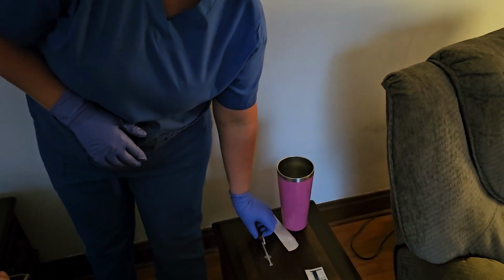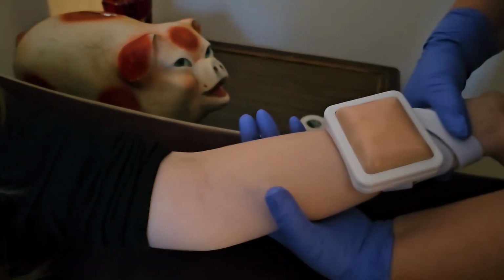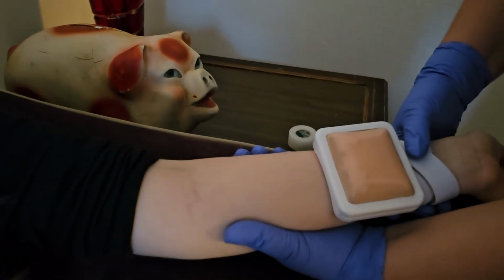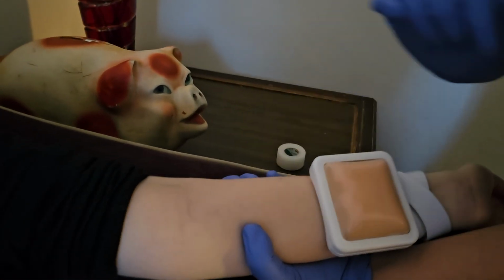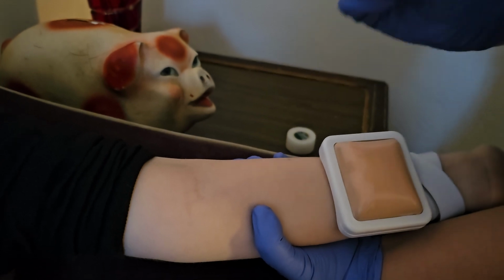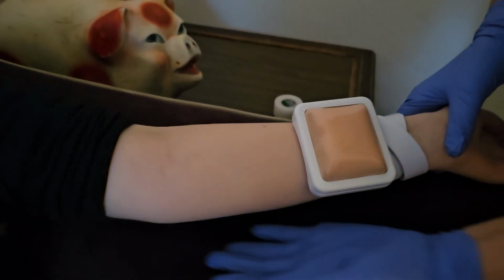All right, next I'm going to demonstrate this first. Next, we are going to pull the skin taut. We do that by placing your hand under the arm of the patient, and you're going to pull outward. Okay, and that'll make the skin taut. And you do that while you do your injection.